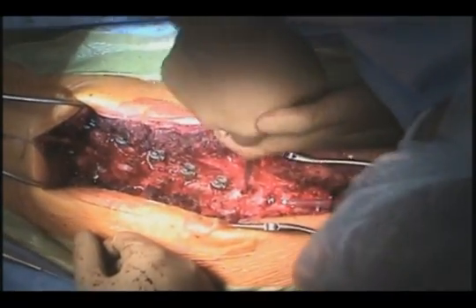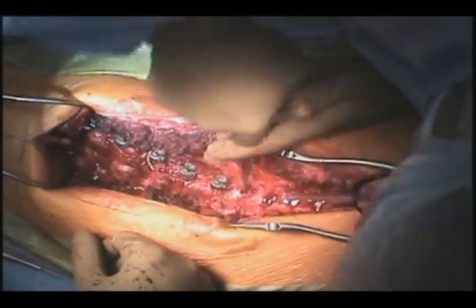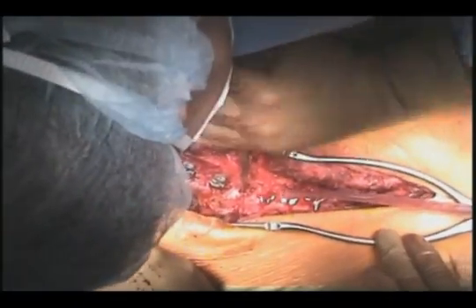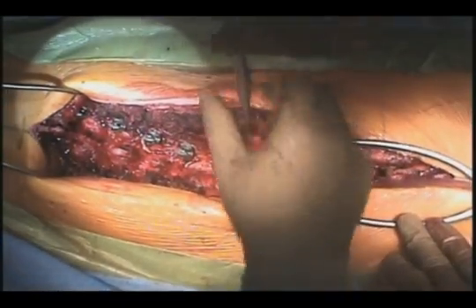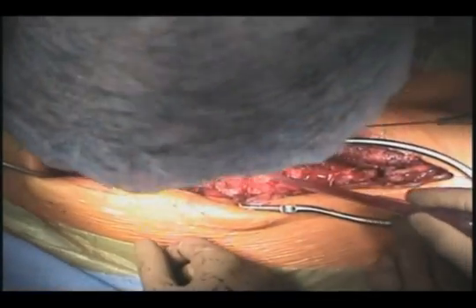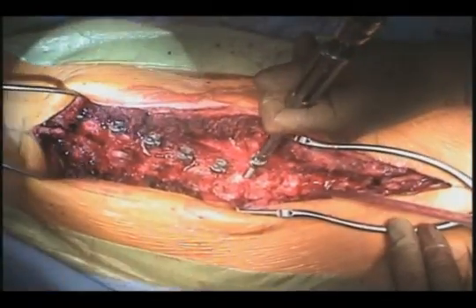And so then being very careful to use the calibrations and to get a good feel of that, I gently rock the probe back and forth. I can see that based on that maneuver I have a firm fixation into the pedicle and vertebral body. And then I'll introduce the feeler again, or the sounding probe. If there's any bleeding from the hole, we stem that with the use of the collagen thrombin combination.